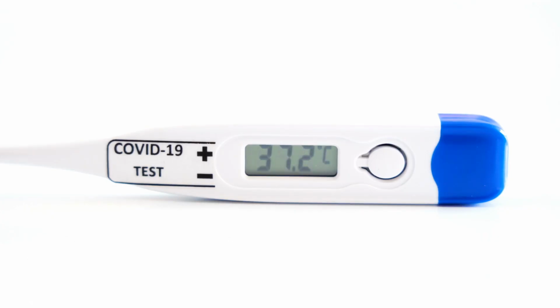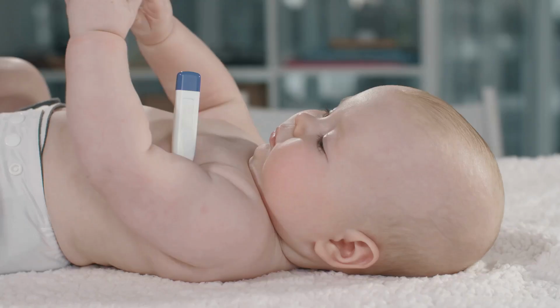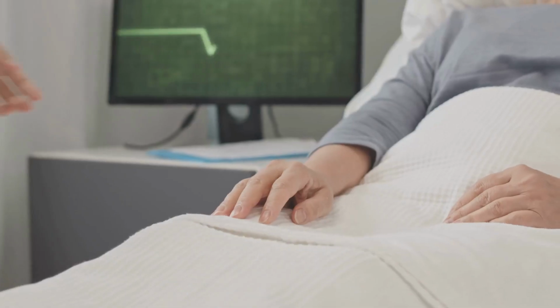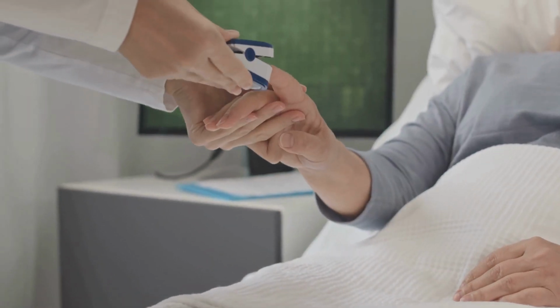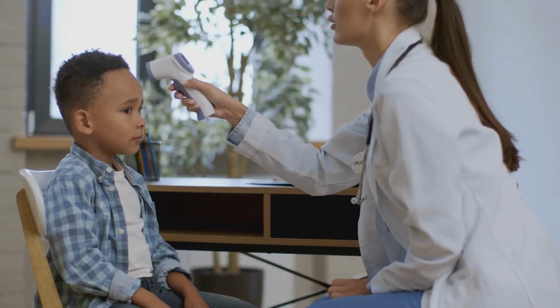Taking temperature, a gauge of health. Body temperature is a measure of the body's internal heat. It can be taken orally, rectally, in the ear, or on the forehead. Oral and tympanic temperatures are common and convenient. Rectal temperature is considered the most accurate but is more invasive.